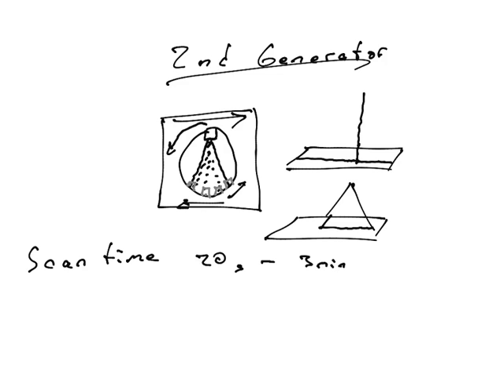And so now all of a sudden you had the ability, being that each slice only took about a minute, and people can feasibly hold their breath that long, to scan the full body instead of just the head. So that's a huge improvement.